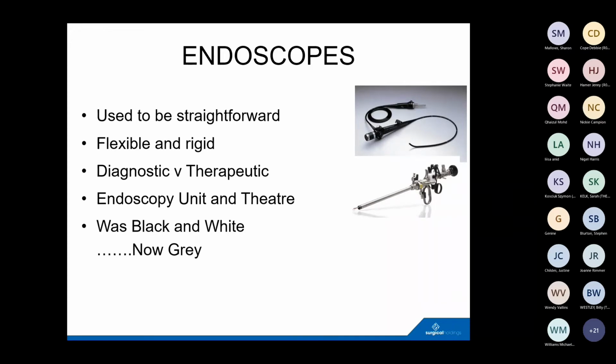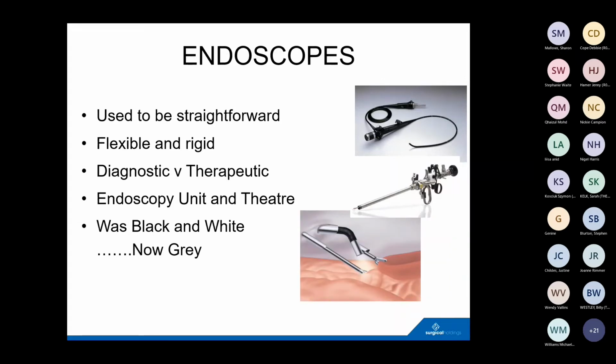They're used all over the place, and you have also things like this, this is a laparoscope with a flexible tip. So it's a rigid instrument with a tip that can move around, and so obviously that gives some fundamental advantage to the operator. This area here would normally be rigid and you'd have to move it very much like you'd use an instrument. But the fact that you can flex the tip means you could actually go behind the area of interest and look back on it. You could go underneath and look up. So it gives a lot of benefits to the operator.